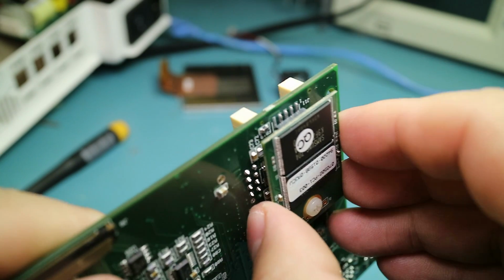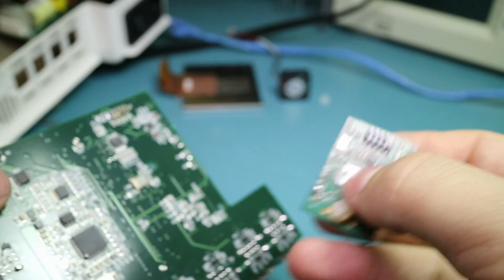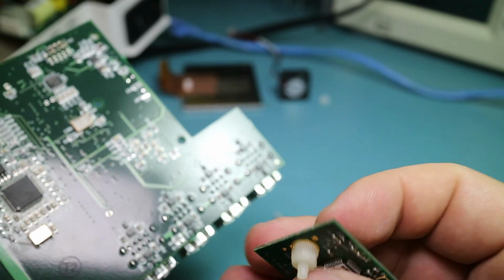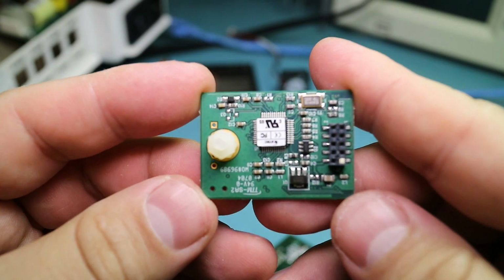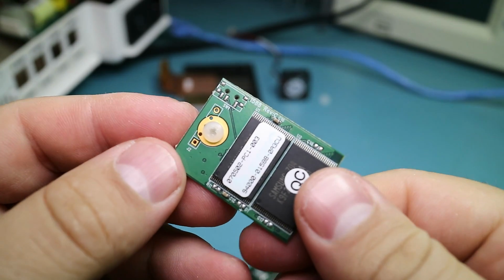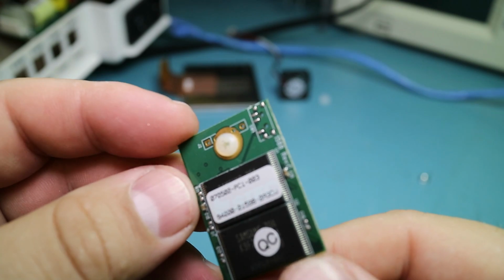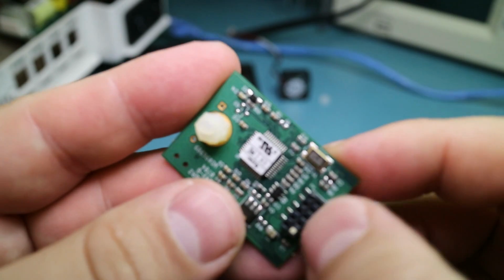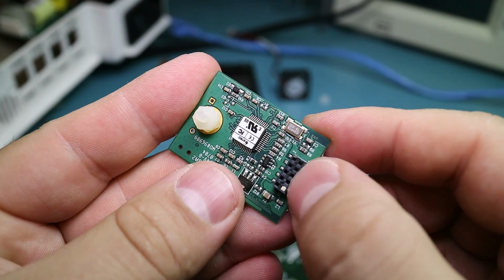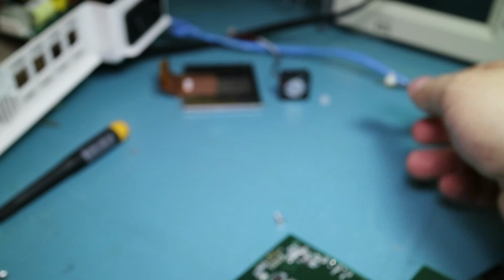And we've got a small flash module here, which is where all the program storage is. Oh, I didn't realize there was a little hex nut on that. I just popped that off. But yeah, this is just a USB based module. I think it's like 256 megabytes, but I'll have to look into it. I don't know how big it is exactly. This is just a smaller pin pitch header, but it's actually just a USB interface. So you could actually just hook this up to your computer if you broke out a USB cable.